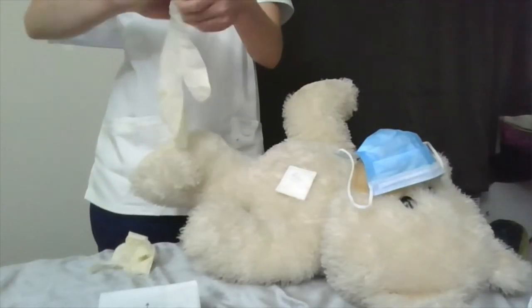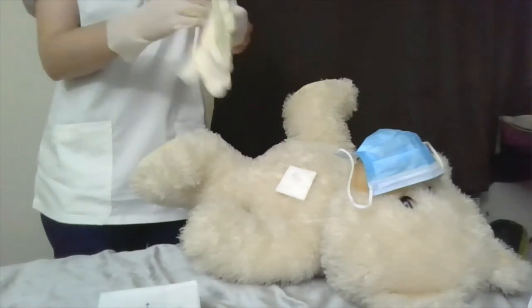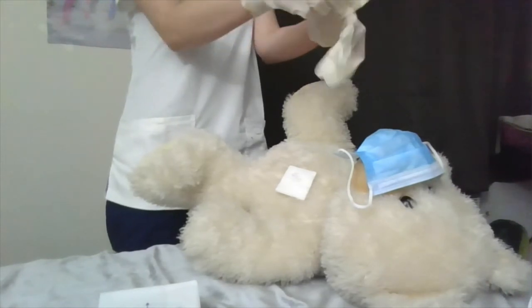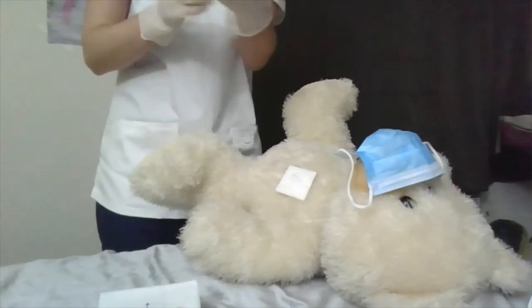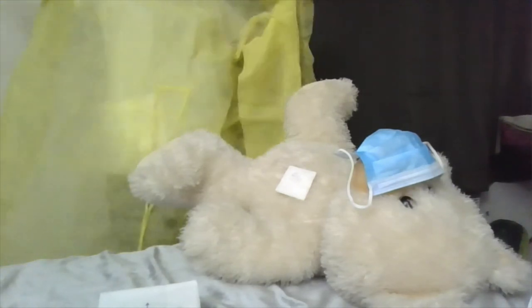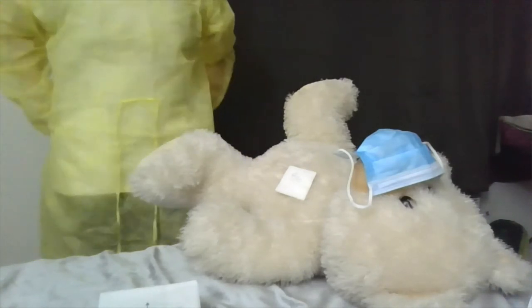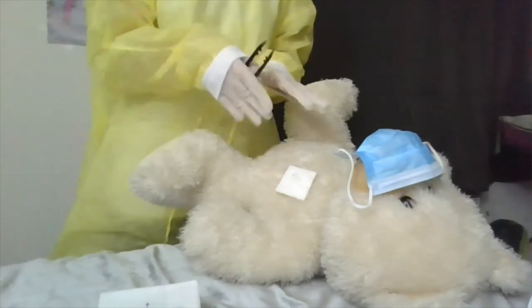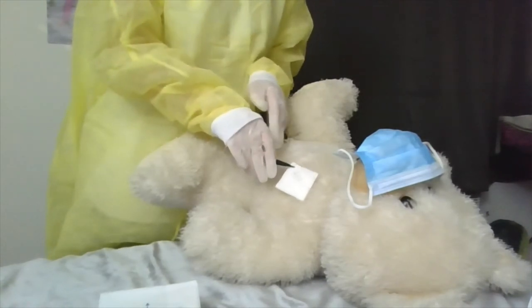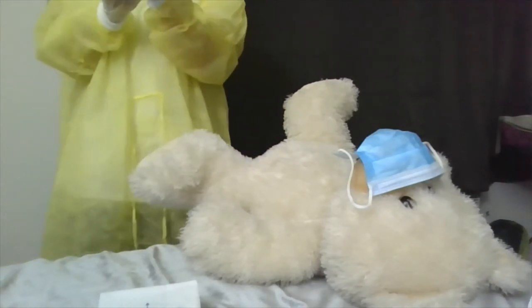I will don clean gloves and my gown, just in case there's any drainage. I will then remove the old dressing — I can see the date from seven days ago and somebody else's initials. I'm going to remove it from the site and discard it along with my clean gloves.